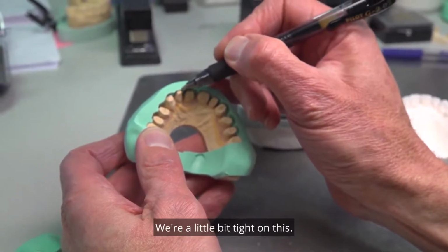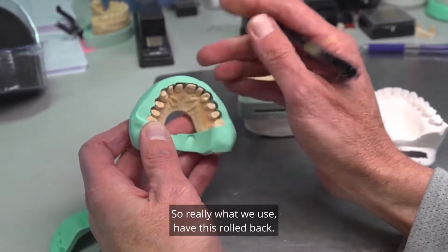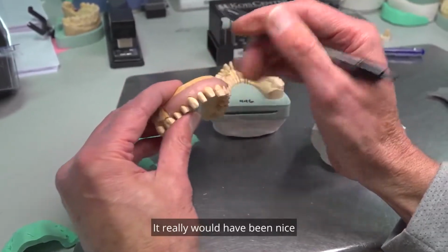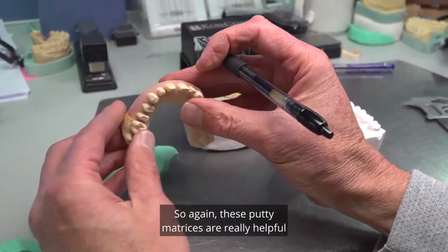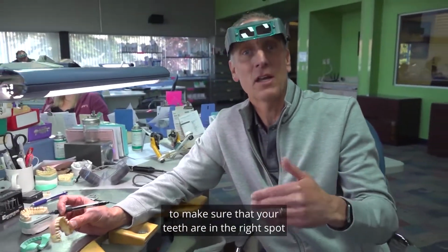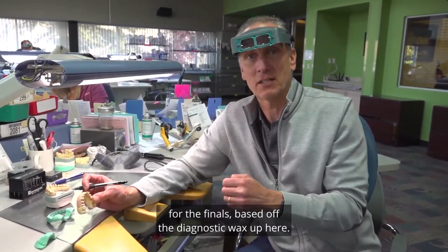Look at this here. We're a little bit tight on this, so really what we can use, have this rolled back. And as we look at this prep on number 7, you can see it's actually kind of sticking out a little bit. It really would have been nice to have a little bit of an incisal edge roll back there. So again, these putty matrices are really helpful to make sure that your teeth are in the right spot, and that we can achieve the results that we're looking for in the finals based off the diagnostic wax up.